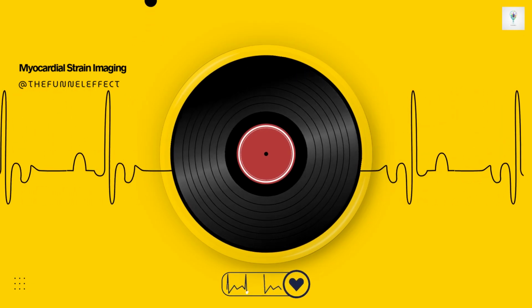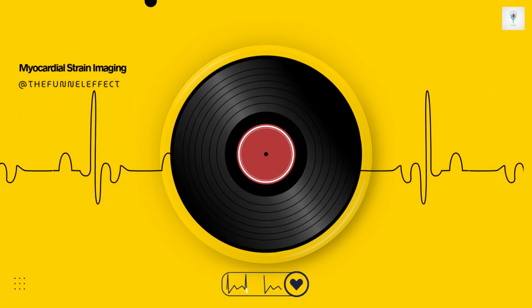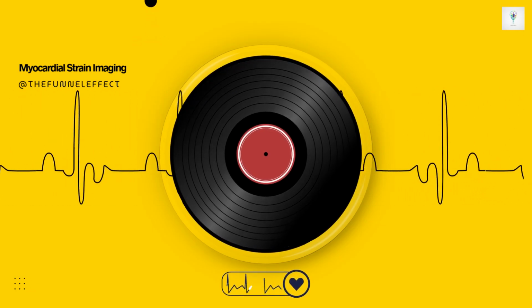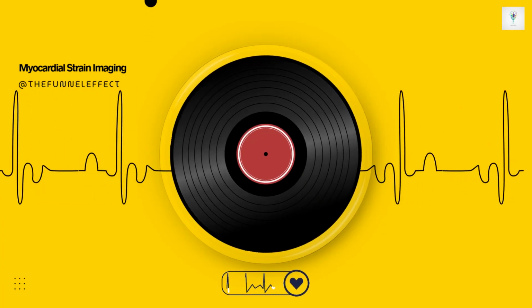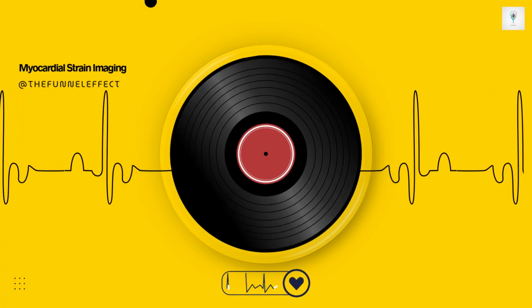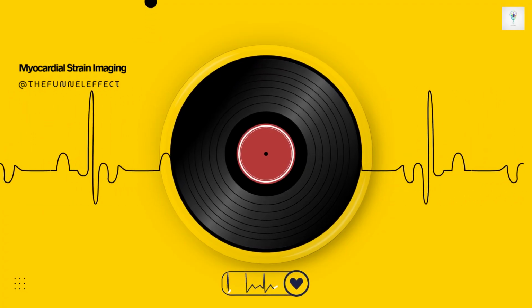As we discussed, those proprietary algorithms mean that strain measurements, especially GLS, show clinically relevant differences between different vendors' echo machines and software packages, and also for CMR feature tracking. We mentioned GLS differences up to 3.7 percentage points historically. That's huge if you're looking for a 15% relative change.